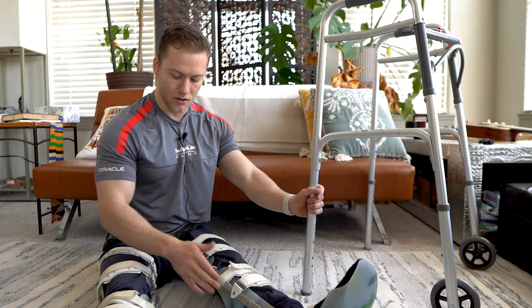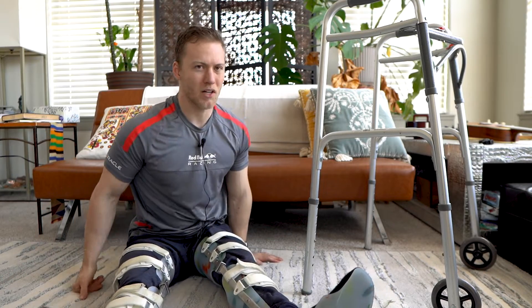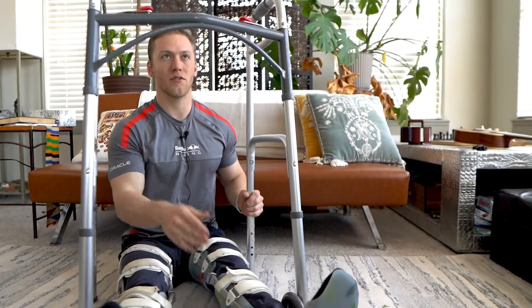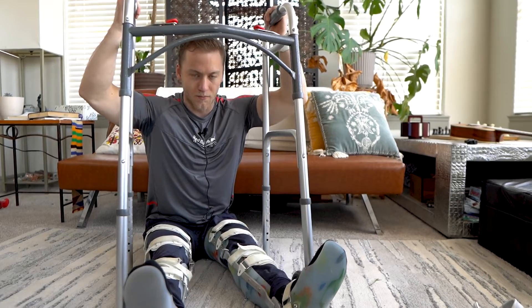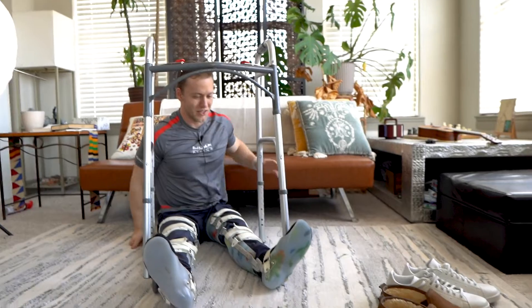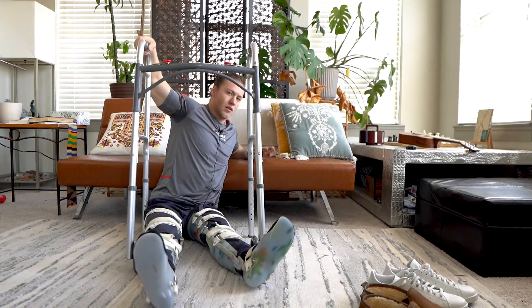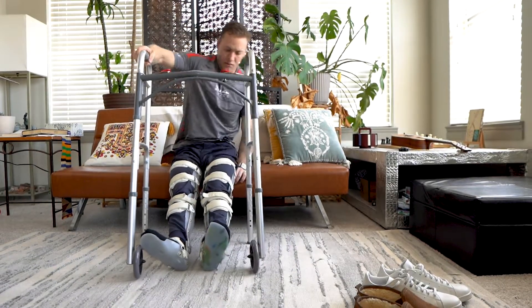If you do happen to put leg braces on on the ground — maybe that's the only open surface you have — I'm going to show you how to get up onto an elevated surface. I once learned how to go from the ground to standing up just with the walker, but I kind of forget how to do it and it's hard. So I'm just going to use the walker: keep it close to you, arm up on here, kind of do a dip, get yourself up, and then pull yourself back.